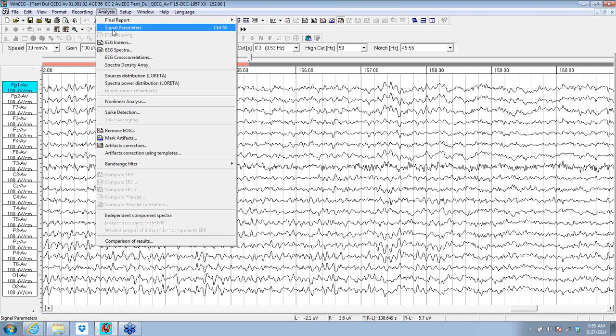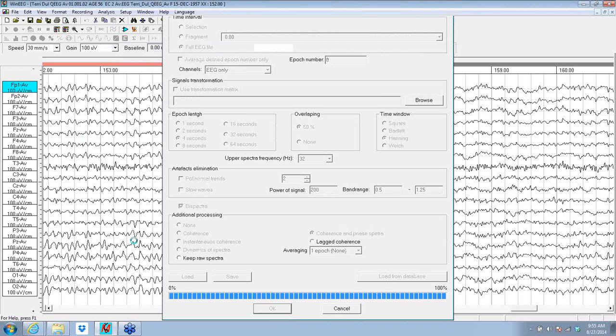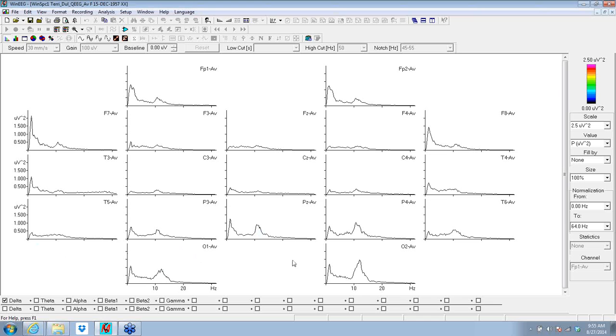Let's take a look at the spectra here on this supposed dementia case with Alzheimer's. Now, Alzheimer's, the voltage goes low and the EEG goes slow. Is a 12.2 hertz alpha peak slow? Last I read it, I don't think that's slow. And the alpha range here starts at about 9 hertz and goes up to almost 15 before it disappears. So if they call this Alzheimer's, I'm going to suggest that that's just plain out a mistake.